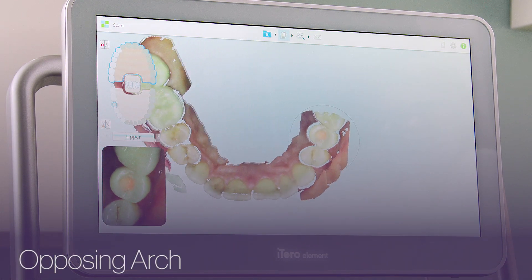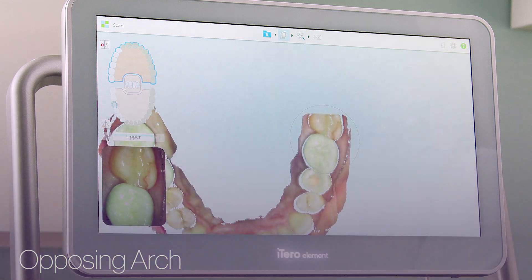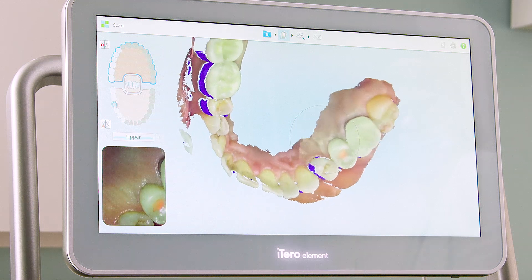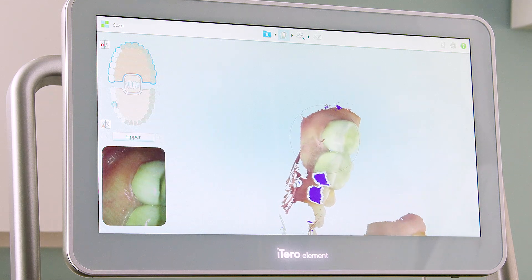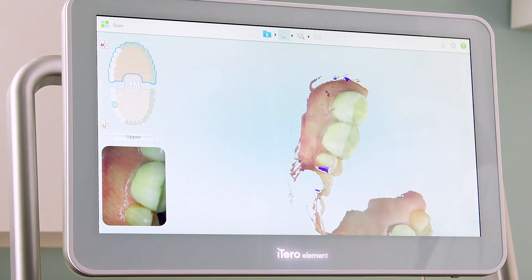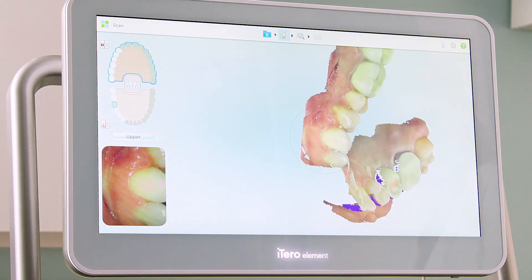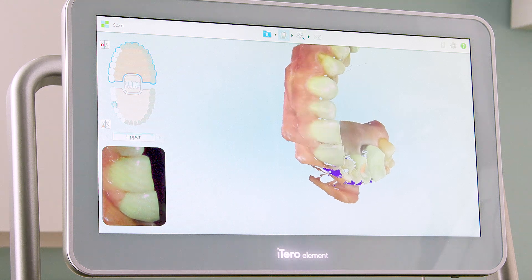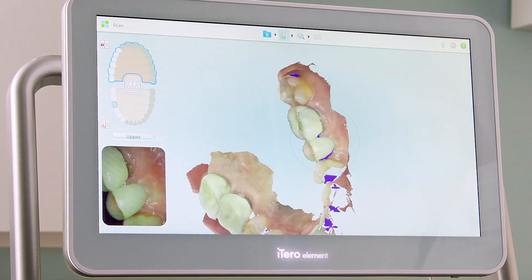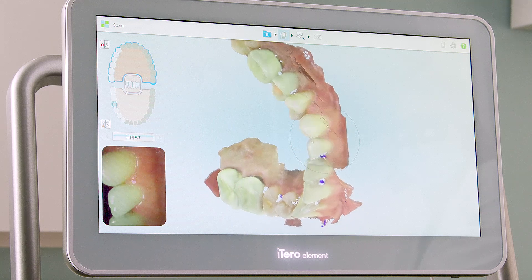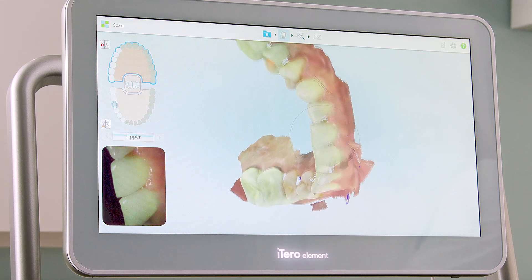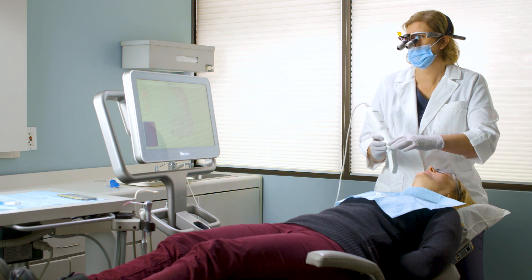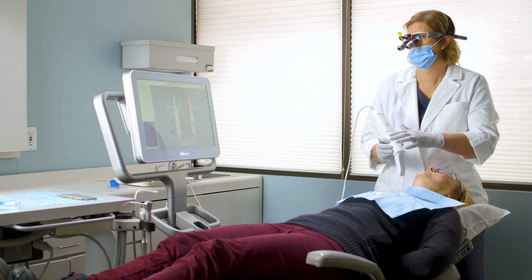In one continuous motion, I will first capture the occlusal, then the lingual, and then the buccal of the opposing arch. I only need to start and stop the scanner when I move between segments. I will use the controls on the wand or the arrows next to the segment indicator box to move between segments.